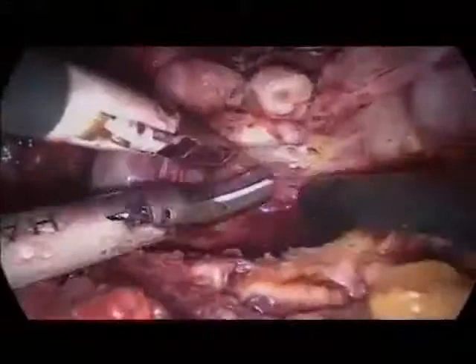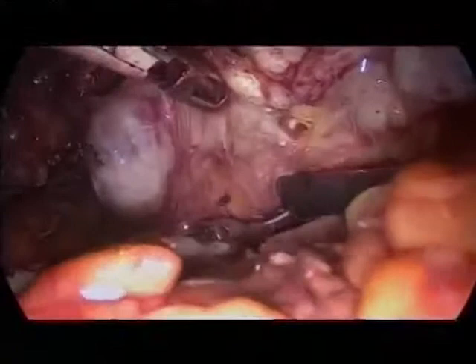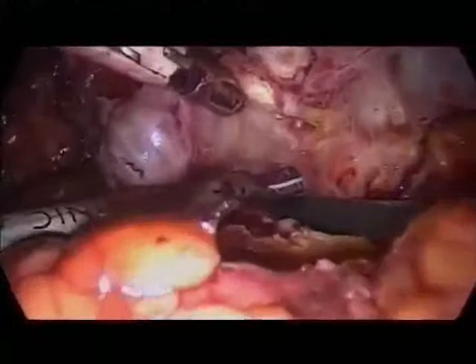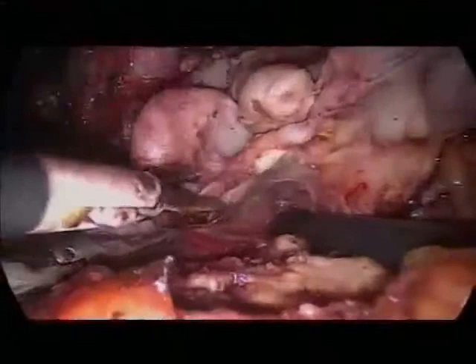Please, can you define your operative strategy if you decide to preserve or not preserve the nerves? Do you use thermic dissection like you have used this morning in any case, or if you want to have a full preservation, do you change and do you use scissors and clips?